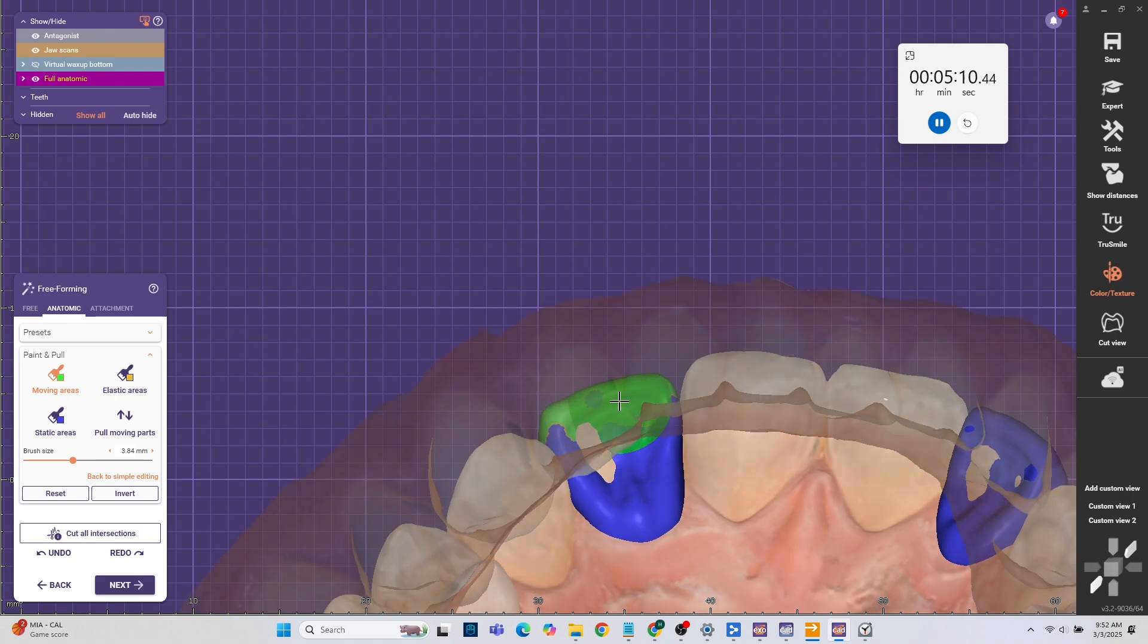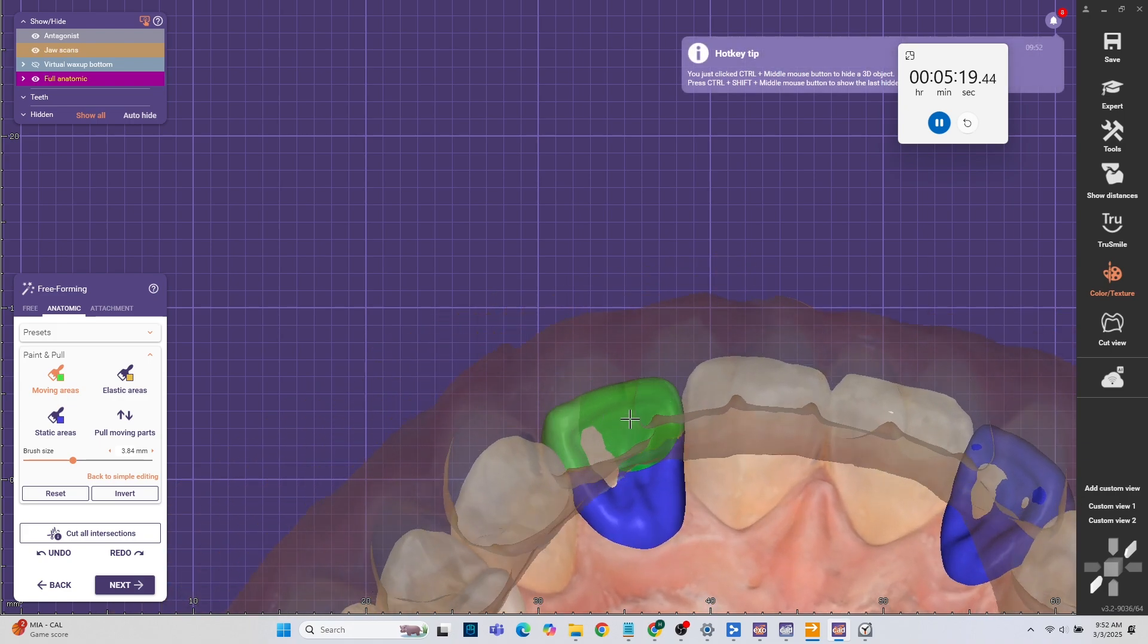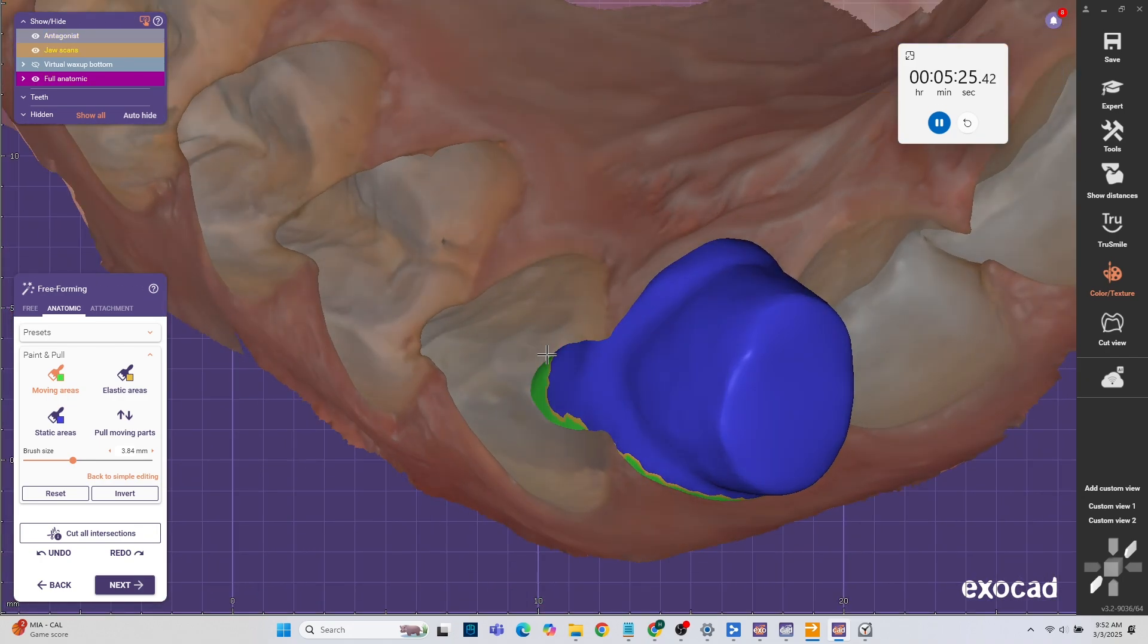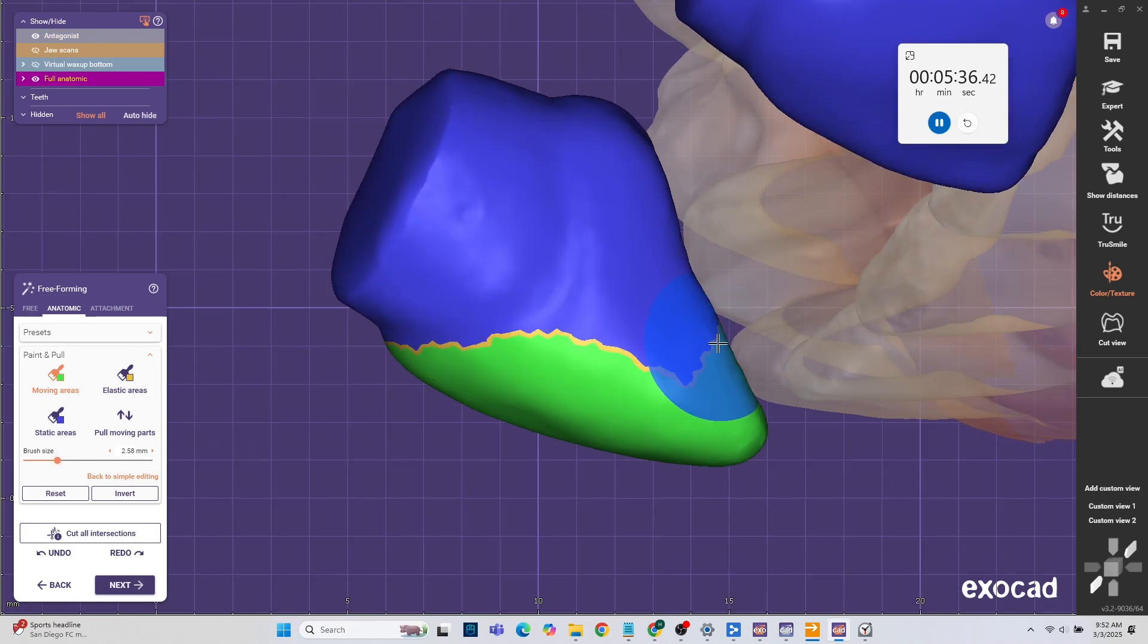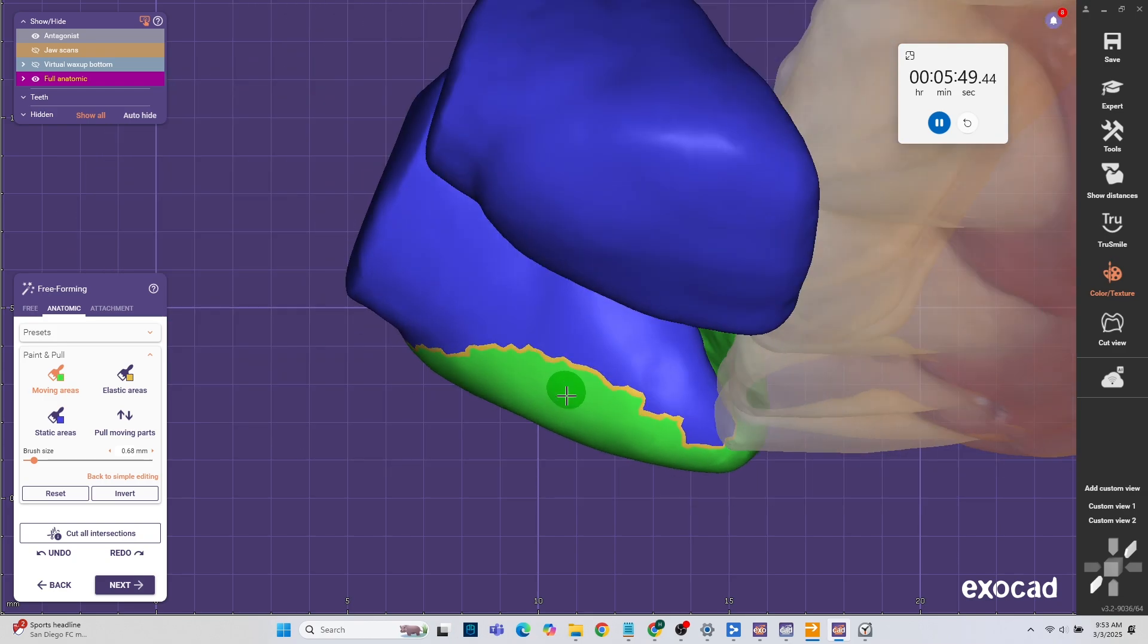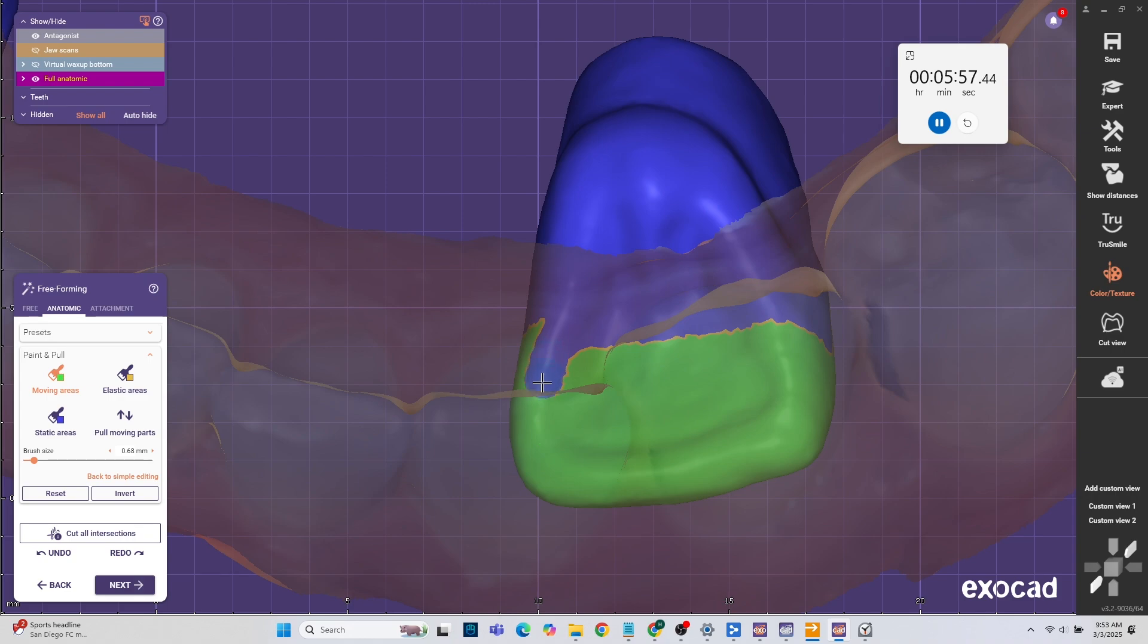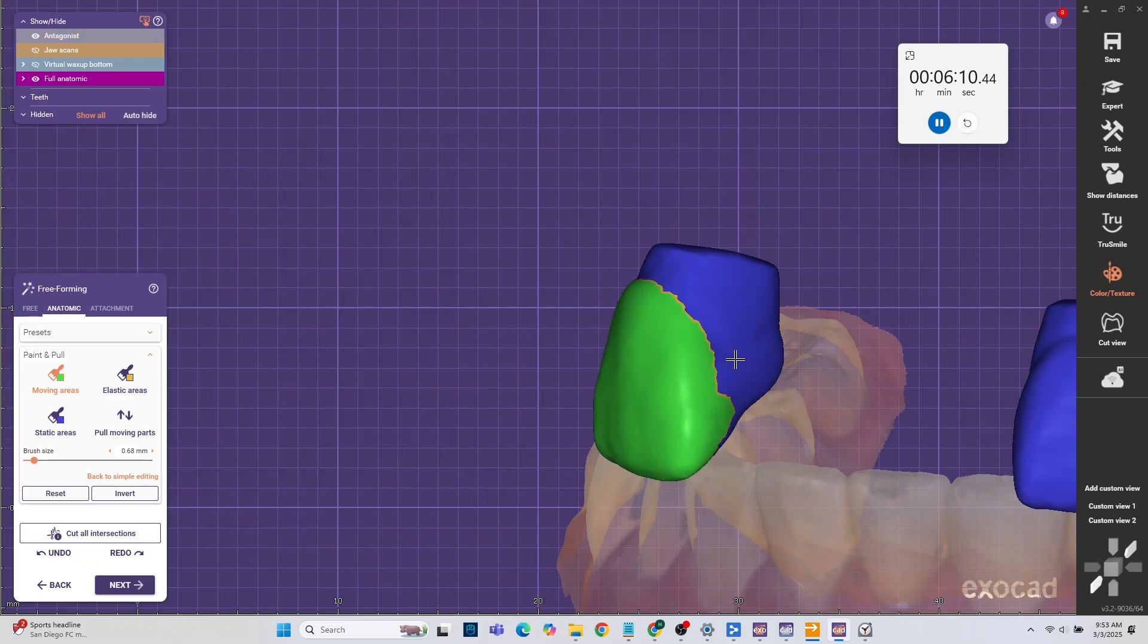This is where we start tricking the program. Obviously there is no module for gingival reduction. People can do it in bite splints. They can do it in different things. But I think this is the easiest. So what I'm doing, I'm basically in the free form stage, in the anatomic portion, you can go all the way down where it says paint and pull. In that option I usually just go to advanced and I paint everything. So everything that's green is going to move without distorting it. Everything in yellow, it will kind of stretch out the STL or the model. So it doesn't really look that great. I'm blocking out only the areas that I don't want stretched out. That's why I chose that little design right there.